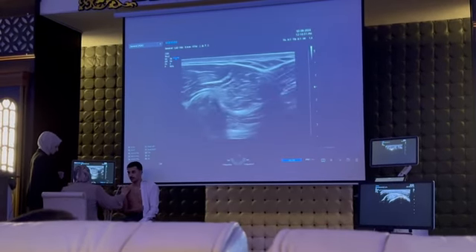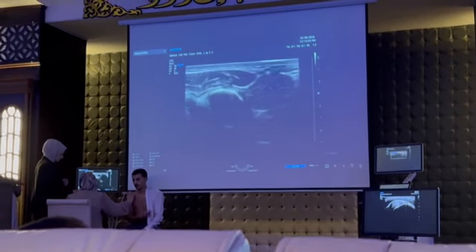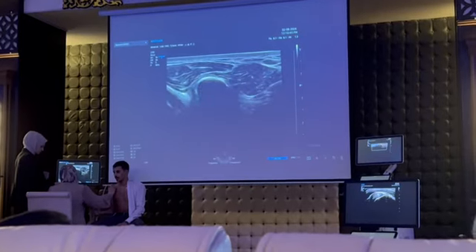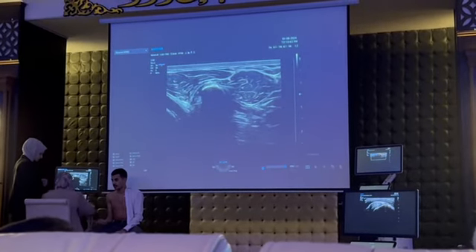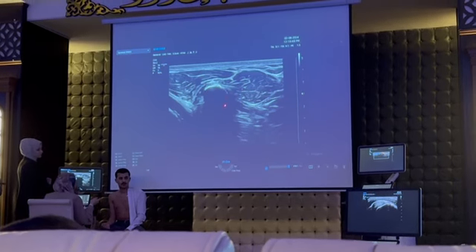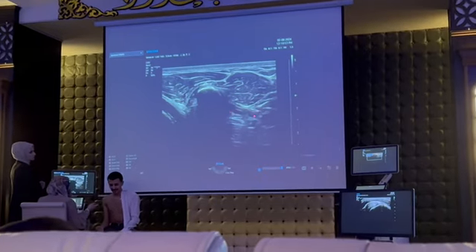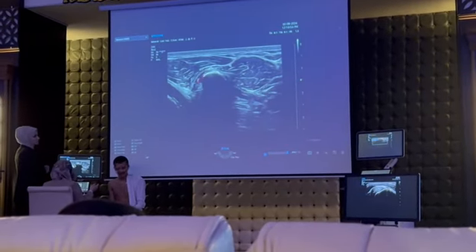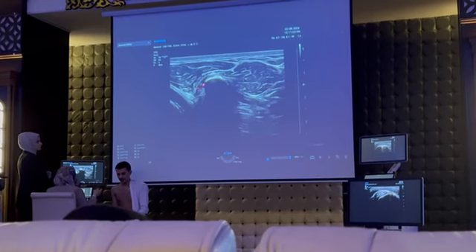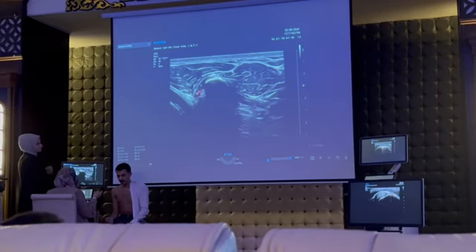What to examine now? This is the coracoid process. The coracoid process gives origin to one muscle medially, but we see just its tendon. This is the pectoralis minor muscle. From the lateral side, it gives two tendons. You see, they are just small tendons. The first anterior one is the coracobrachialis, and the one below is the short head of the biceps muscle.